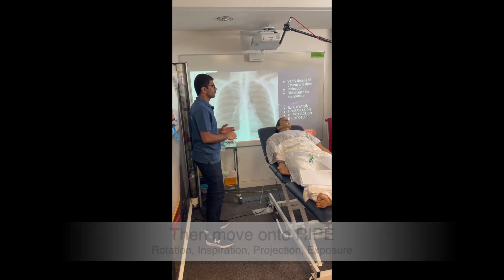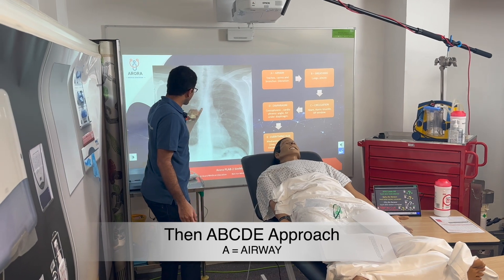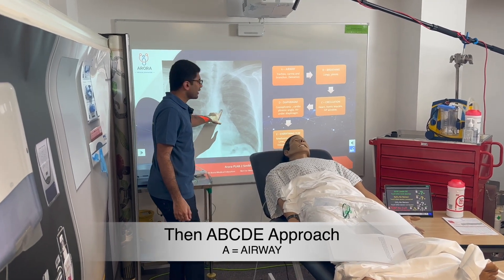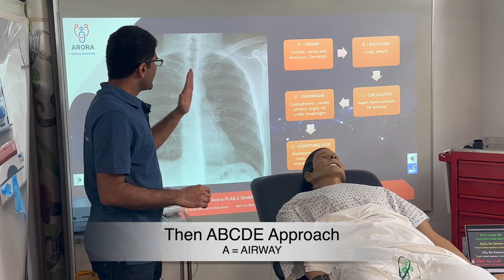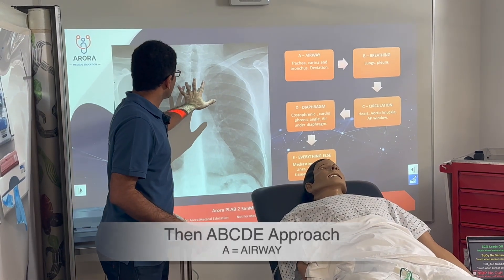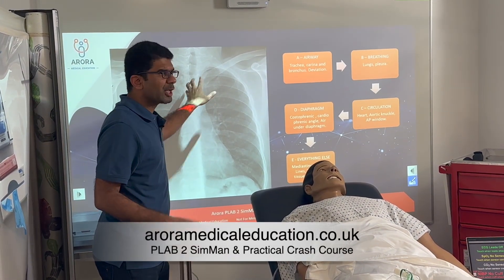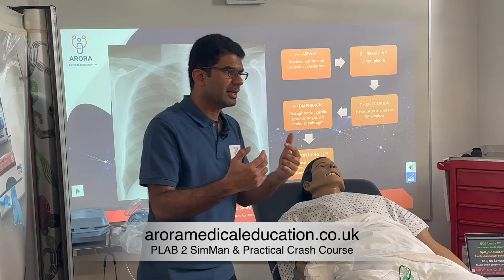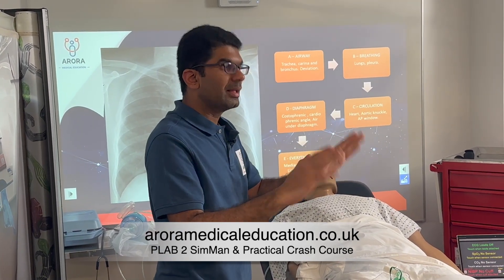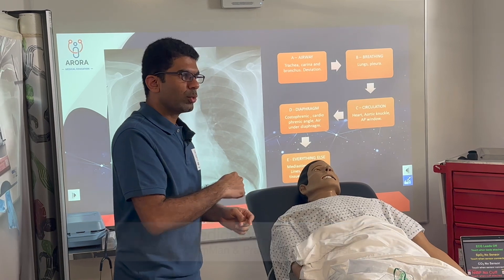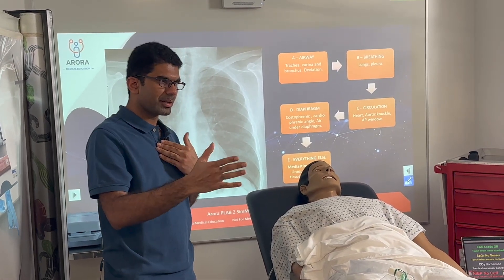A is your Airway. We look at the trachea, then the bronchus, and any deviations. We've already checked if the spinous process is equidistant from the medial end of the clavicles — if it is, we know the film is not rotated. Then you can comment on the trachea: whether it's midline or has been pushed or pulled to one side.